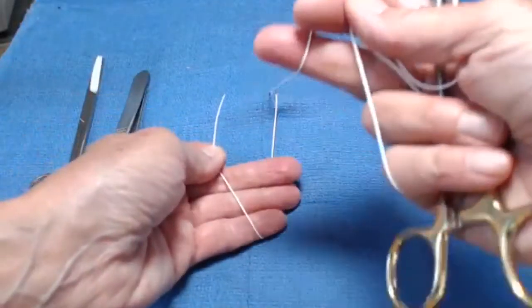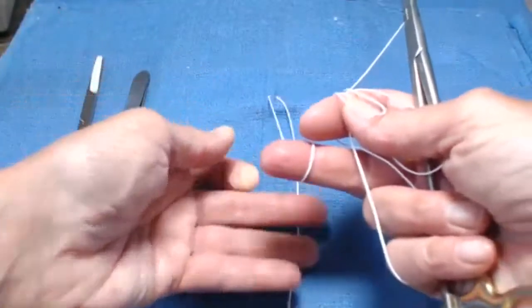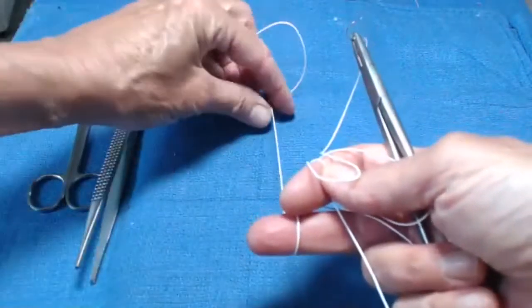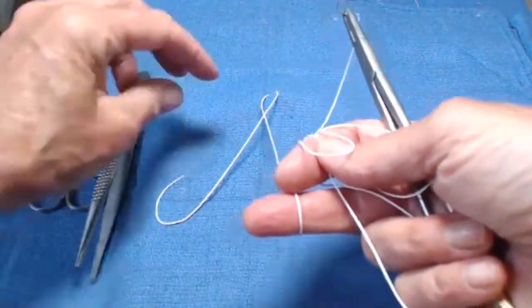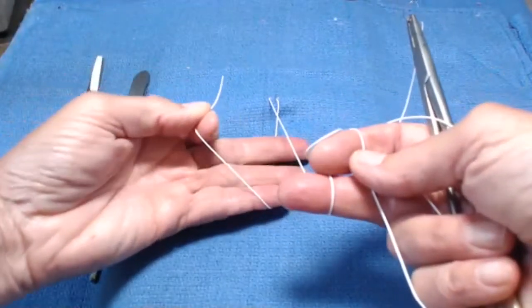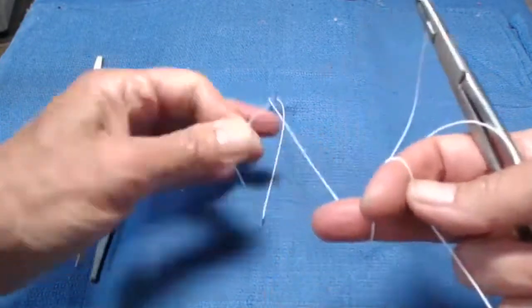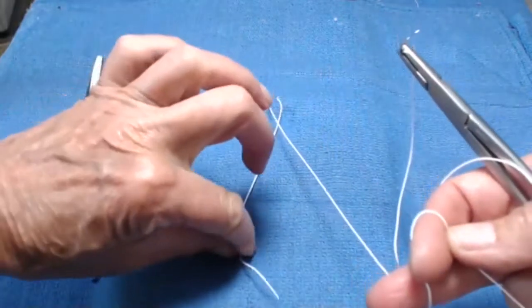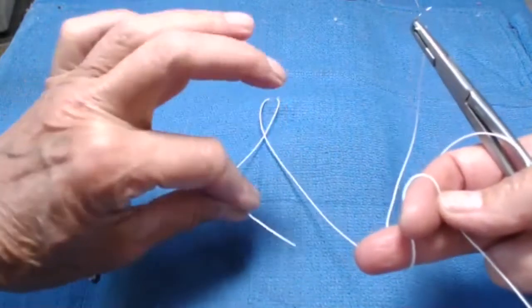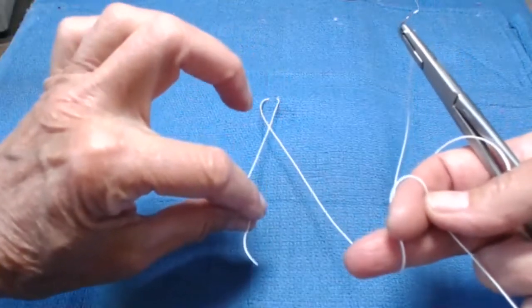One note about how we start: if your short end goes underneath, we're going to start with the palm up. If the short end goes on top, we'll start with the pointing. So it doesn't make any difference which throw you start with. My preference, just because this is how I learned, is to start palm down — picking my short end up with my palm down, picking it up between my thumb and index finger. I'm going to demonstrate it very slowly so people can take their time and practice along.